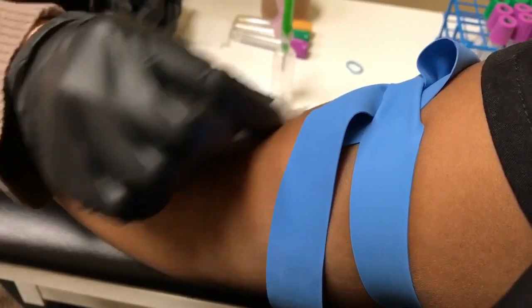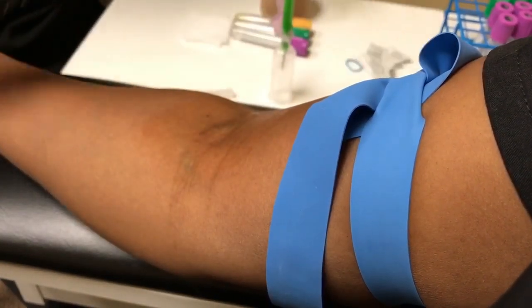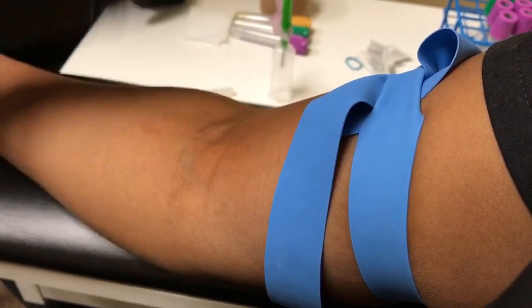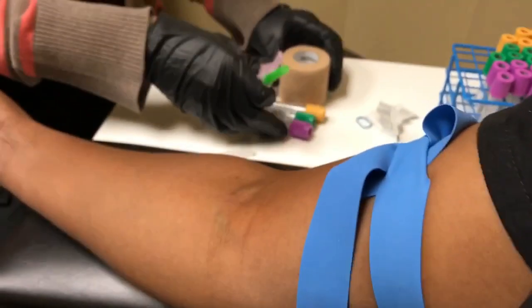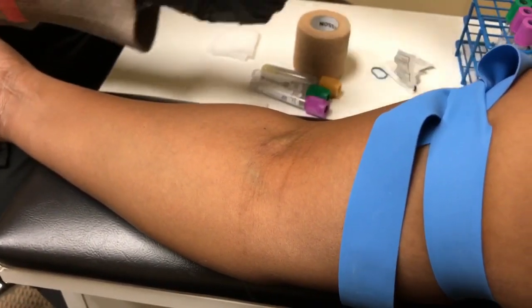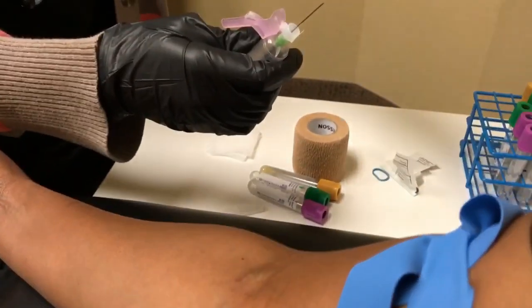I'm going to do the alcohol. You're supposed to work your way out. And as a courtesy, I always dry the alcohol. Then you're going to pull back the safety feature and take off the cap.